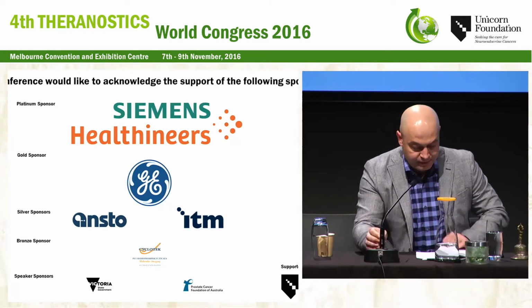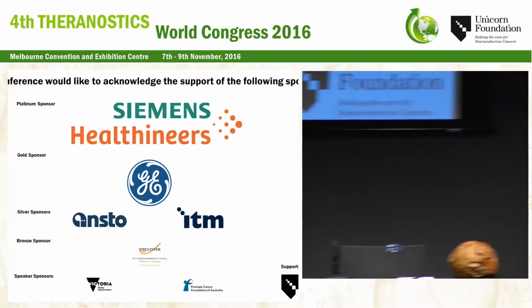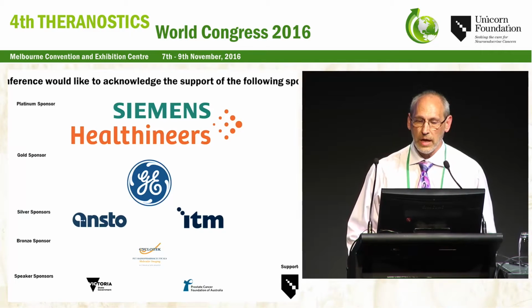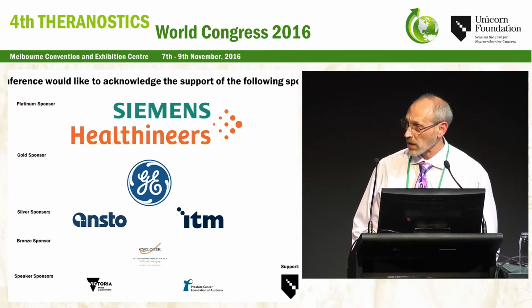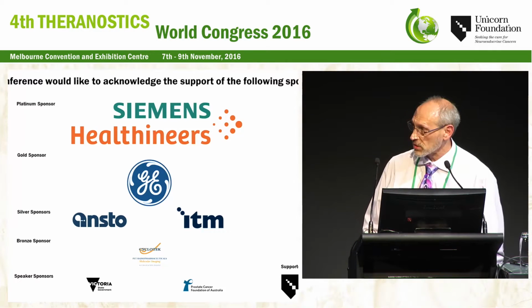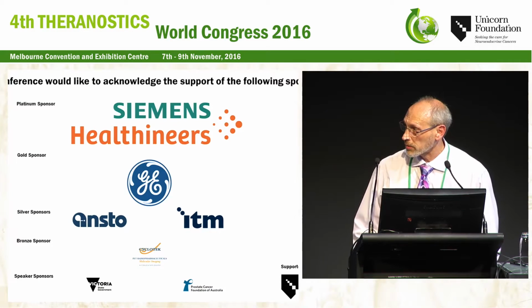Yeah. So this was done on a Siemens MCT. It was done with time of flight. We did not use the resolution recovery on this particular data set. We acquired in a single bed position for 30 minutes.